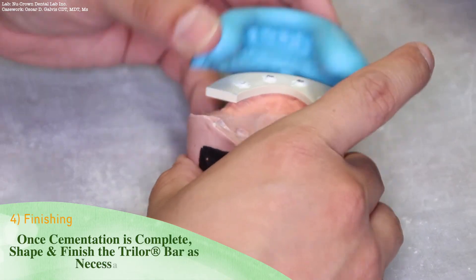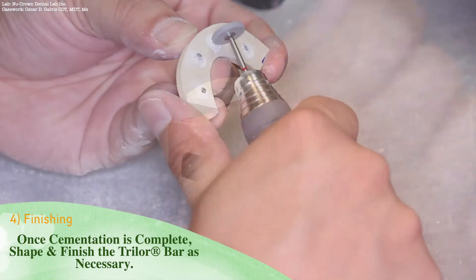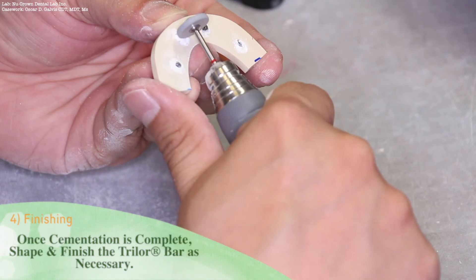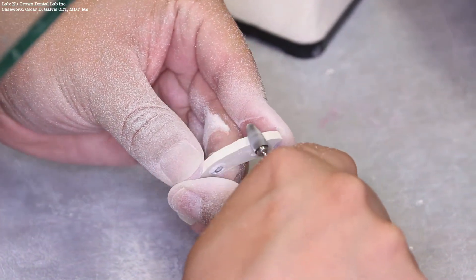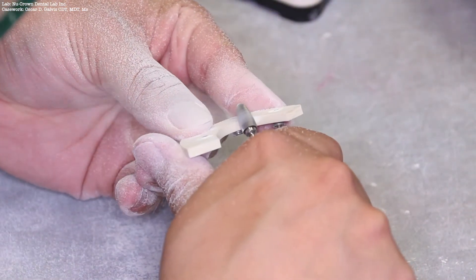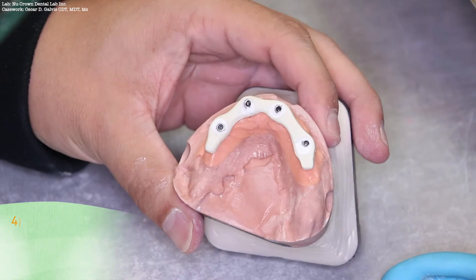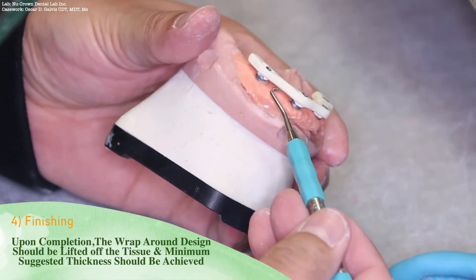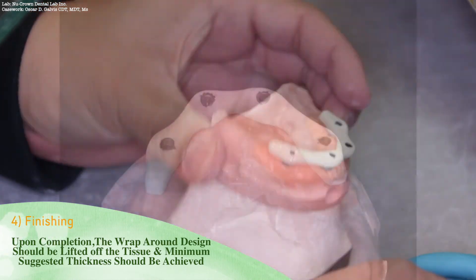Once the cementation process is complete, you may shape and finish the Trilor bar as necessary. Use the matrix to guide you in the overall contours of the bar substructure. The wrap-around design should be lifted off the tissue and the minimum suggested thickness should be achieved throughout the Trilor bar substructure.